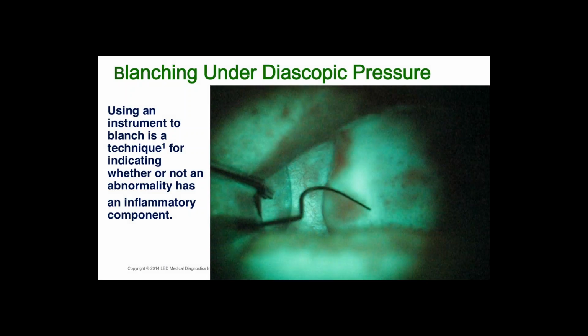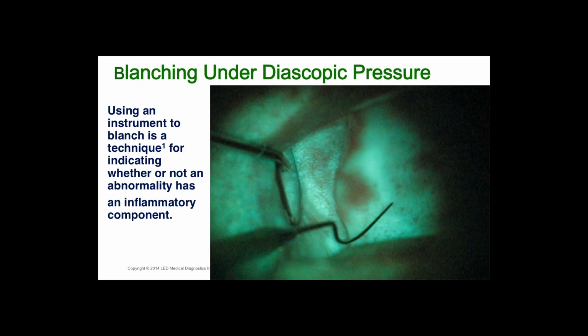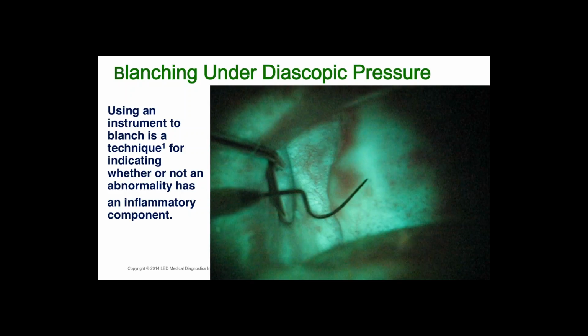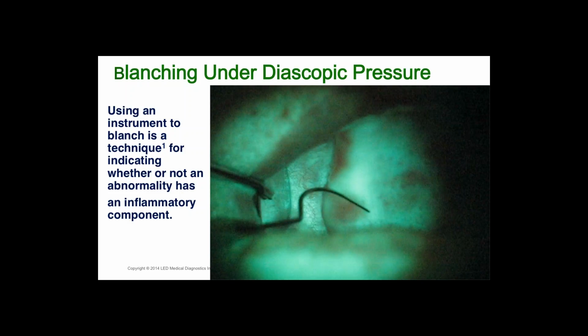So one of the things that I mentioned to you is hemoglobin absorbs its wavelength. You see a red spot on a denture. How do you really know it's a denture sore? You assume it is. The beauty of the VELscope is you're going to know it is. And the way we're going to know that is, when you see something of concern, the first thing you're going to do is take your Explorer back of your mirror and gently rub across it.